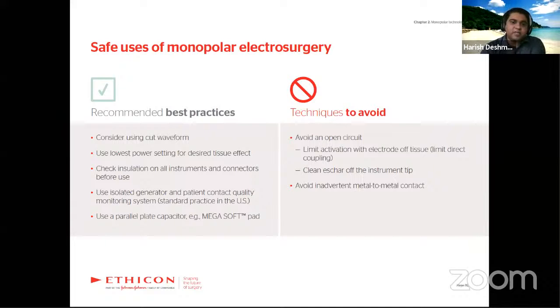Use an isolated generator and patient contact quality monitoring system. It is said as isolated generator because every electrosurgical unit box emits heavy electromagnetic waves.